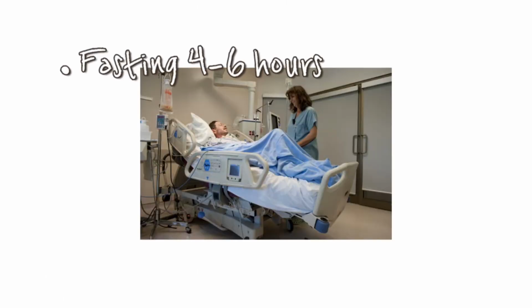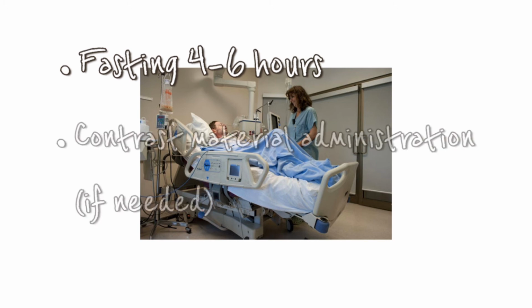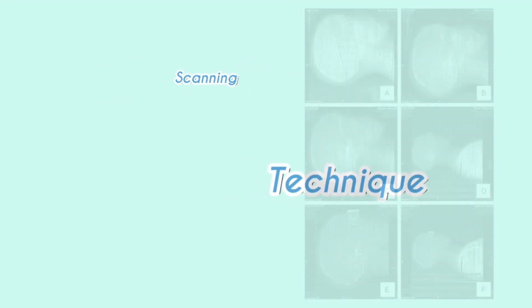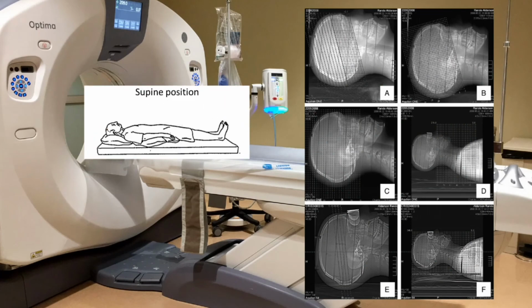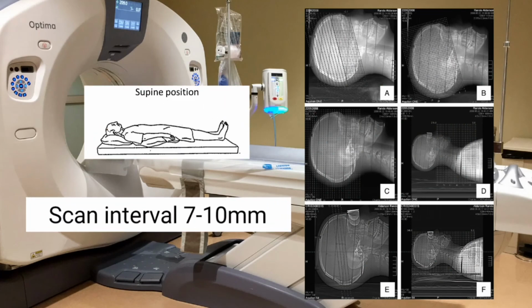Before scanning, patients must be fasting for 4 to 6 hours and injected with contrast agent if needed. Patient must lie down in supine position and the scan interval should be in the range of 7 to 10 millimeters.